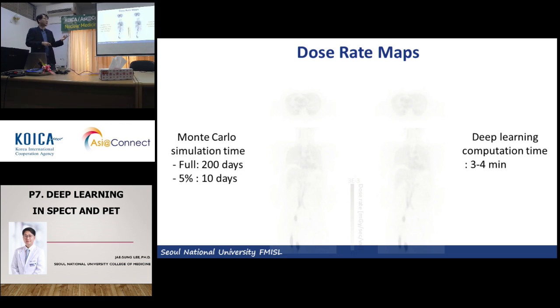But I would say that Monte Carlo simulation is much more difficult but a much more accurate method than any value-based ones, because basically it means that we calculate the S value for each different voxel with different activity and different attenuation coefficient. So yes, this is a more advanced technique than our previous approach.